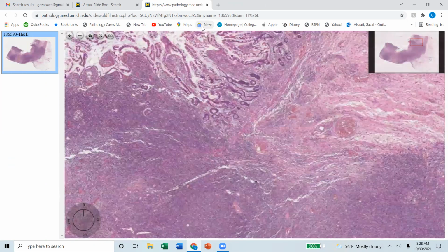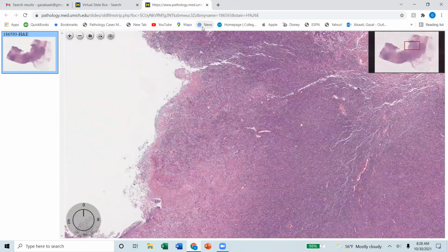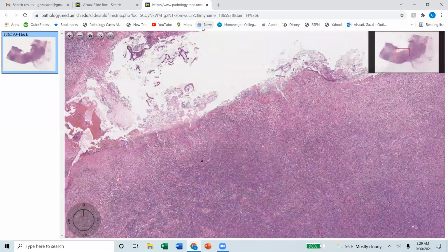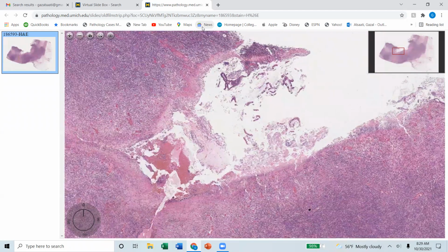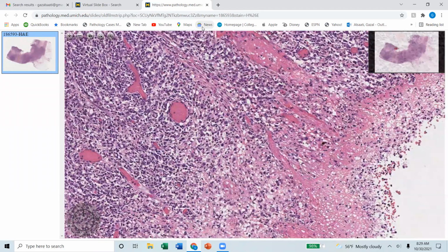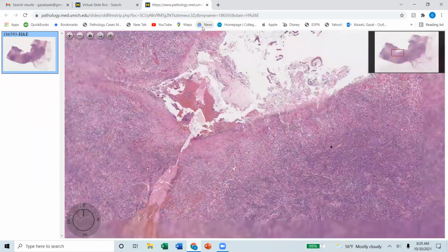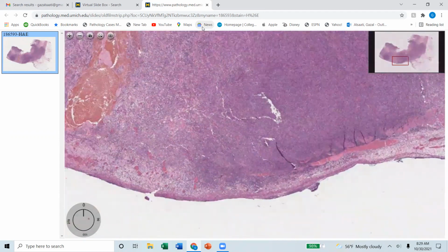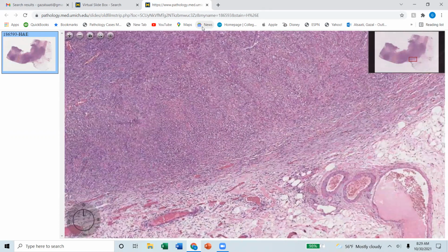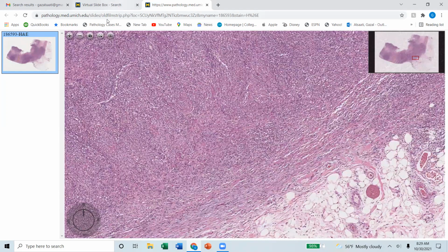You guys are challenging me with resections. I don't do resections. There will be all that ulcer in there, and this is again a T cell kind of phenomenon, and you'll see all sorts of mixed cells in there as well. In the periphery, I think there are more CD8 positive T cells, and it's going to be EBV positive and EBER positive.